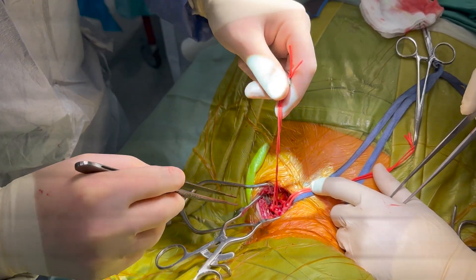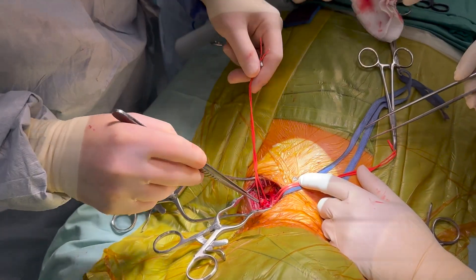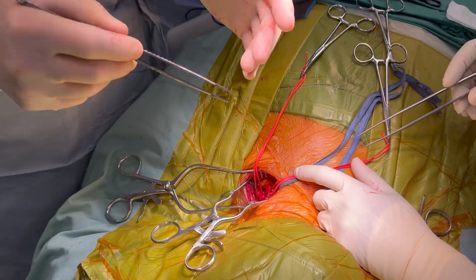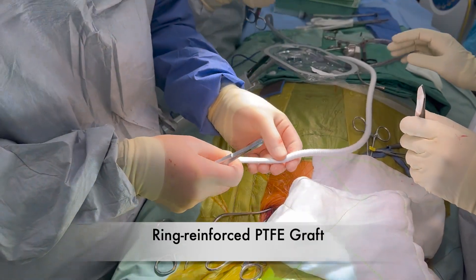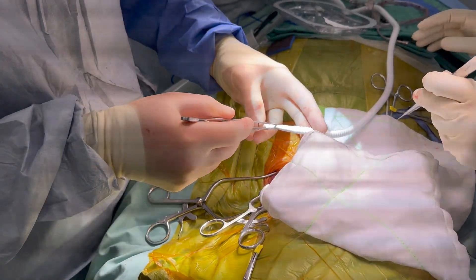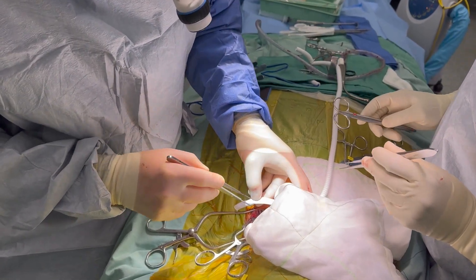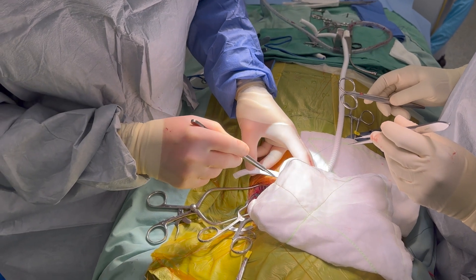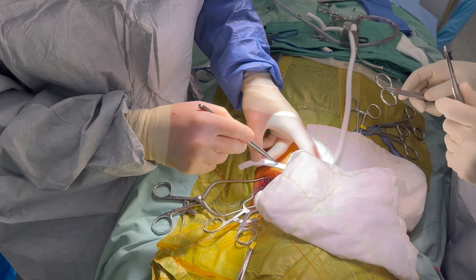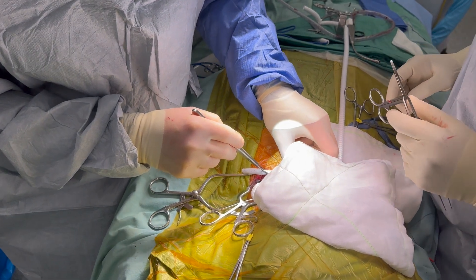With heparin given, we'll perform an end-to-side anastomosis here onto the subclavian artery. Then I'm going to divide the common carotid and perform an end-to-side anastomosis of the common carotid onto the graft. The ring-reinforced PTFE Propaten graft is positioned so that the left common carotid anastomosis is in the non-ringed area, but the rings are retained within the tunnel.